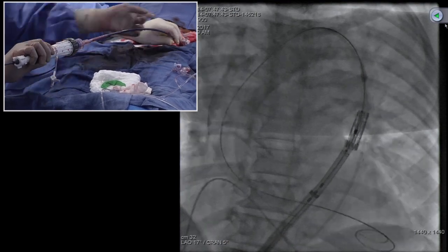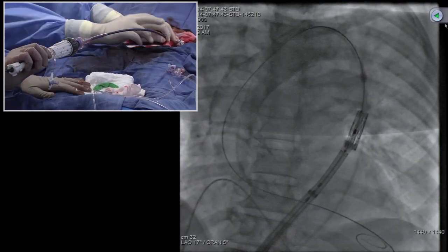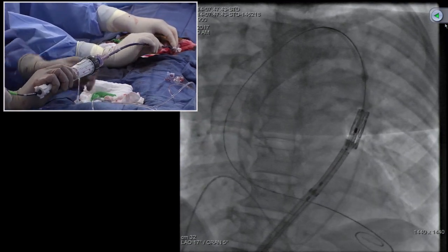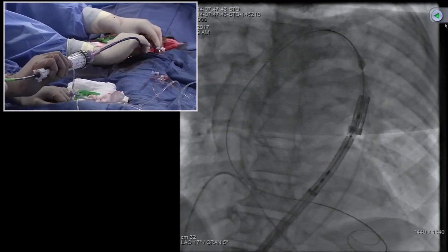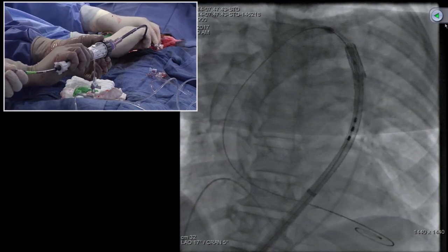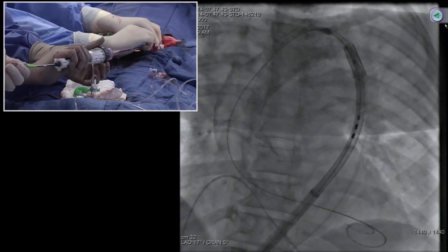While advancing, and you're advancing, so that does not touch the aorta. The step which Dr. Keeney just showed in the new design, the Sapien Ultra, will actually come fixed, and this step will be removed. And now you have to make more flex, so it does not touch. More flex.